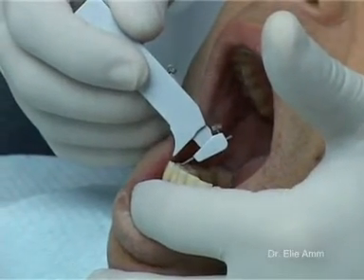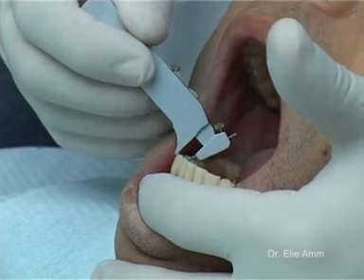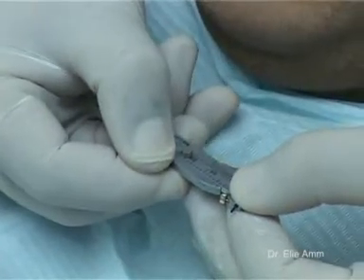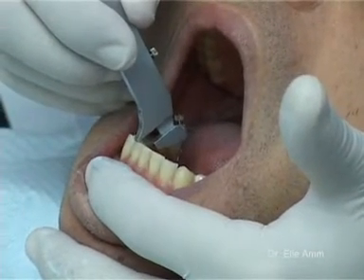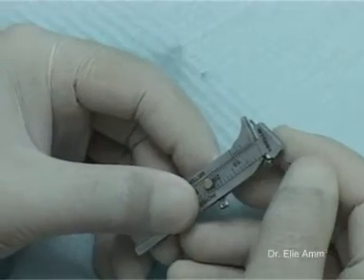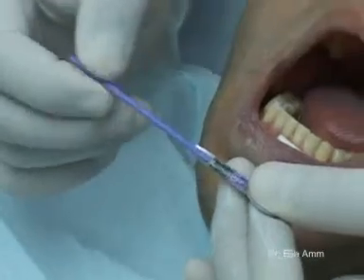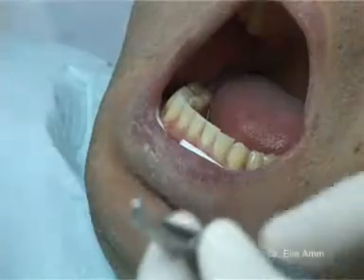With the gauge, we mark the height for each bracket. Lower cuspids at 4.5 or 5 mm according to the clinical crown size, and we can find this is 4 mm. Lower incisors at 4 or 4.5 mm. The lead must be edge-to-edge with the stainless prong and the graduation starts at 1 mm. Self-etching primer is then applied. Note that this solution doesn't dilute or remove the pencil marks of the gauge.